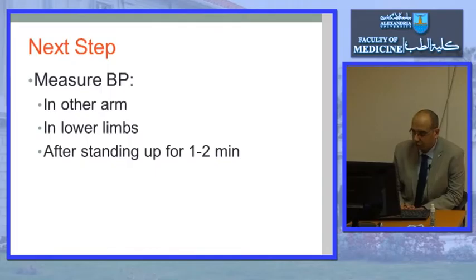A common question for doctors: which arm should I use? We should measure the blood pressure in both arms, and I use the higher reading. I should measure the blood pressure in both arms, and I use the higher reading. This is very important.